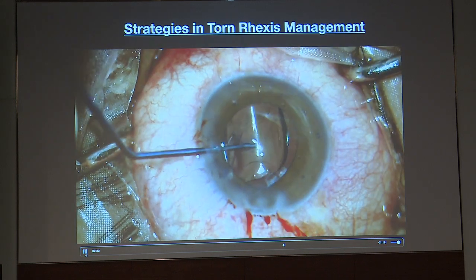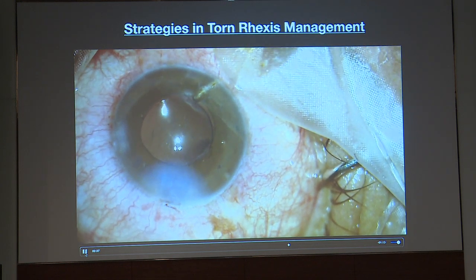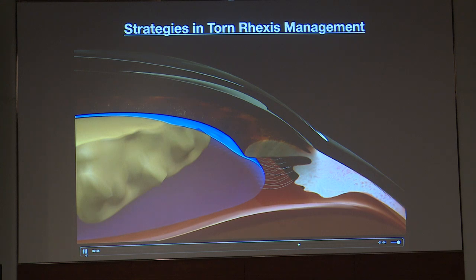Flap motility. For better explanation, these animations show that the pre-equatorial tear is everted and freely fluttering in nature. The hypothesis for the fluttering flap is that the end point of the extension of the flap functions as the pivotal point for the flap. The flap, being short, is responsive to the fluid dynamics of the anterior chamber and thus flutters freely.